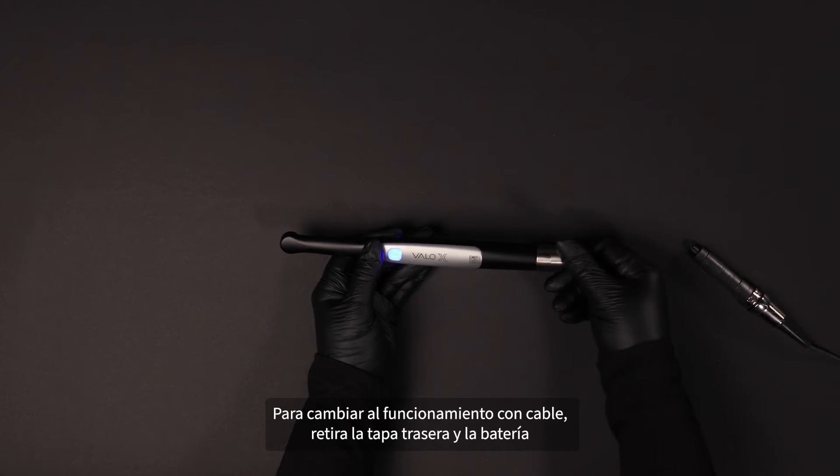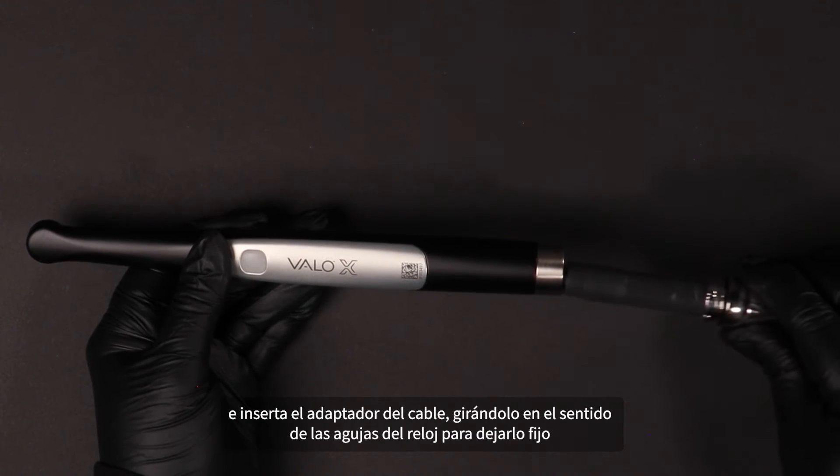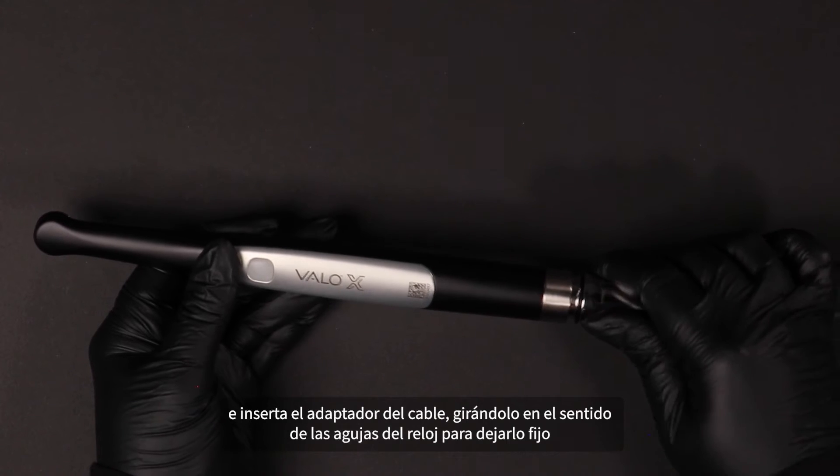To switch to corded operation, remove the back cap and battery and insert the cord adapter, turning it clockwise to lock it into place.